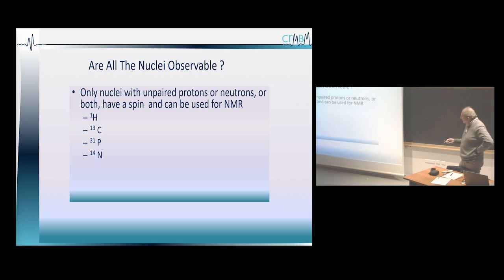And I didn't mention that for C13, it's mainly related to spectroscopy, and people are looking at the glycogen within the muscle using this. Okay, so glycogen, you know what it is. It is a kind of pool of sugar inside the muscle. It can be inside the liver as well, and you can do NMR spectroscopy of C13 to follow the changes in glycogen if you want. It's not easy, but this is possible.